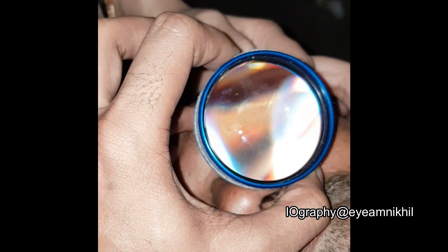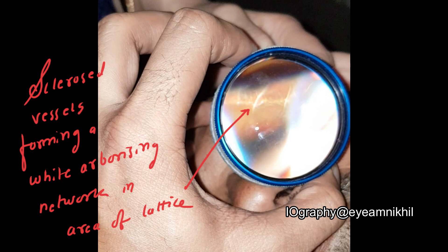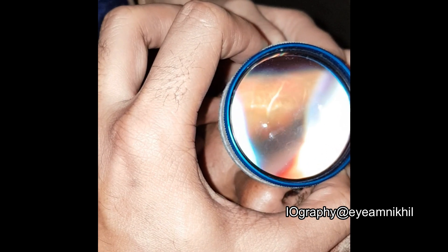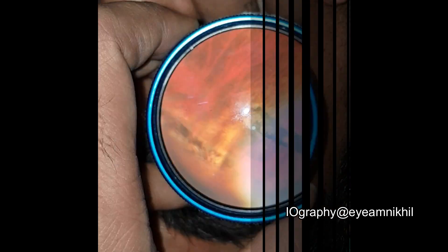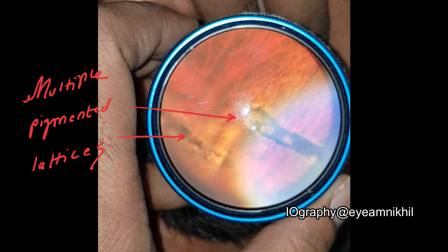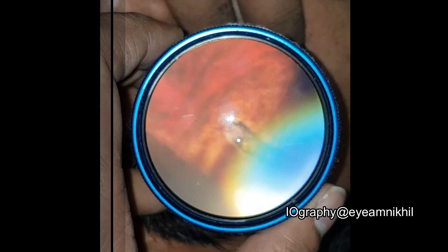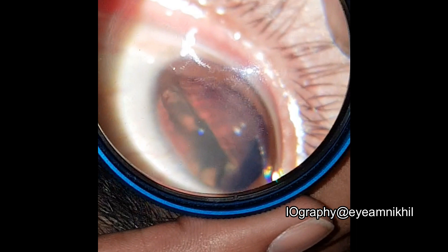This is how a lattice looks like. You can see a wide network of sclerosed vessels in the area. Here you can see multiple pigmented lattices, and here a single pigmented lattice located inferiorly. The pigmentation is due to hyperplasia of the retinal pigment epithelium.